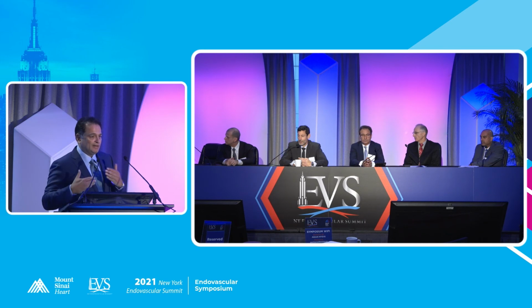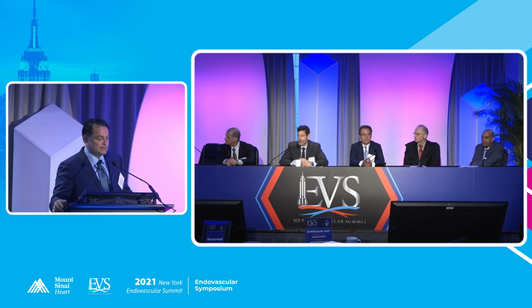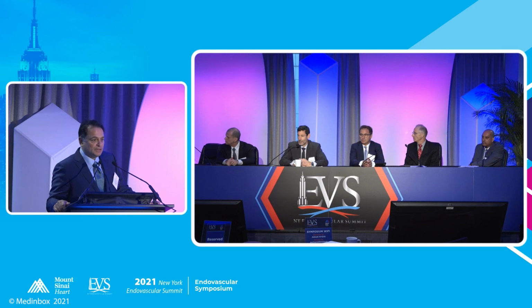So you kind of have to go with who you trained and talk to everybody. So to create an algorithm just for atherectomy devices is very, very difficult. But I will say that atherectomy, I think, is proven very clearly to be an adjunct, not a final therapy. I think the final therapies are very clear right now. It's either drug-coated balloon or drug-eluting stents in the femoral popliteal segment. So I think that's probably the best way to answer that question.